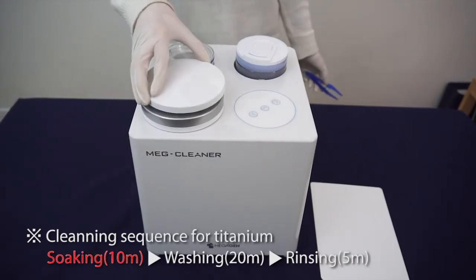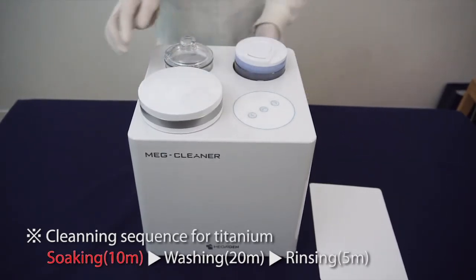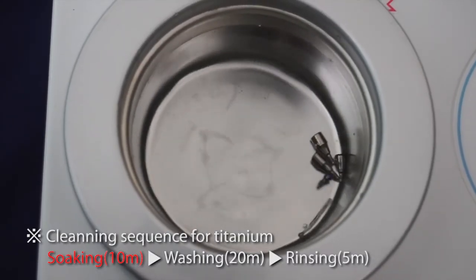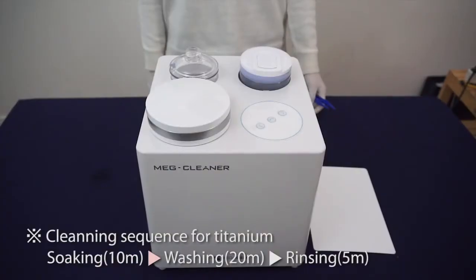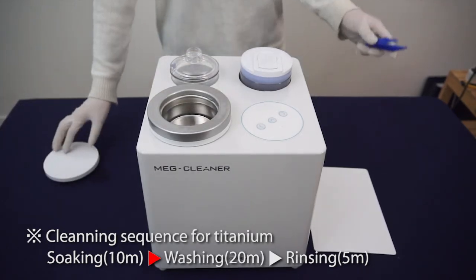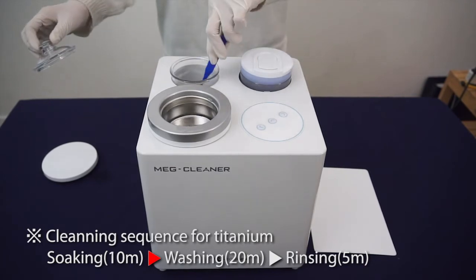Put in the object for cleaning, turn the soaking switch on, and wait for auto-power off after 10 minutes. After finished soaking, 20 minutes of washing — move the object to the washing jar by plastic tweezers for more effective removal. Put the object at the edge of the washing jar.